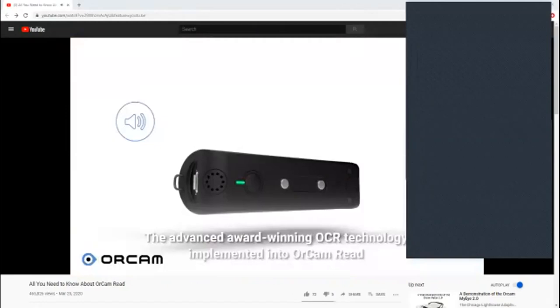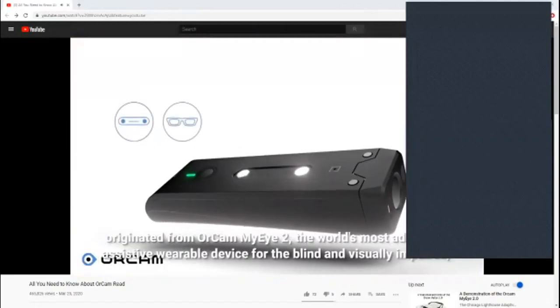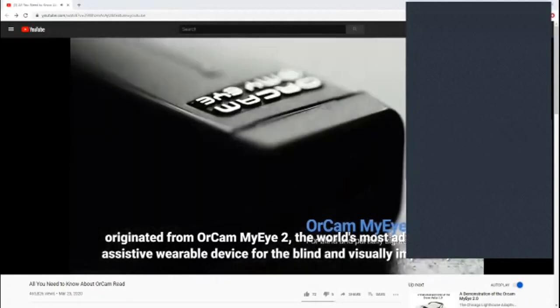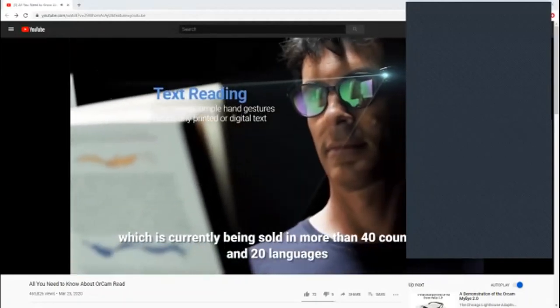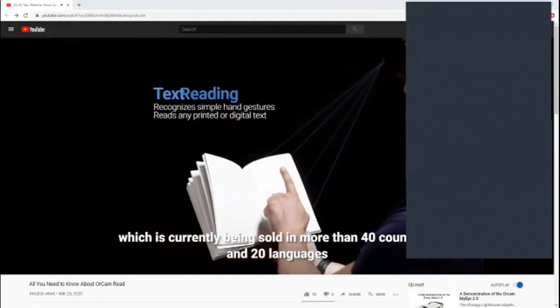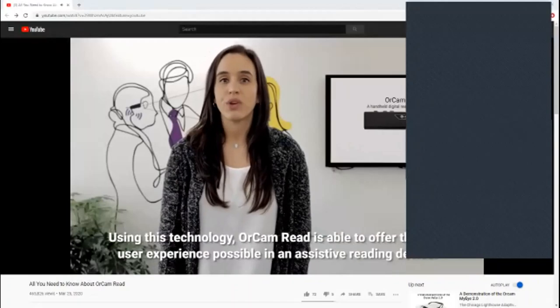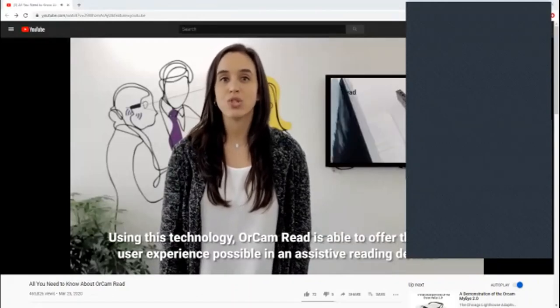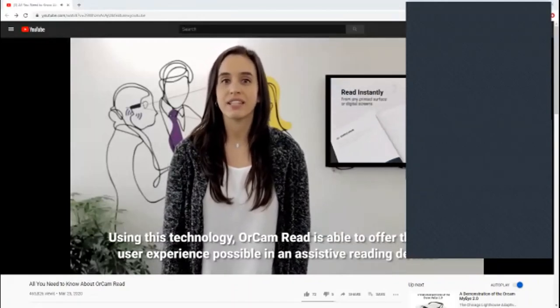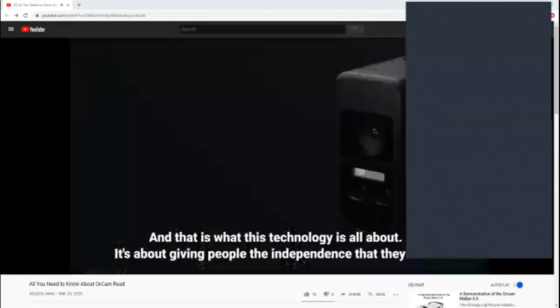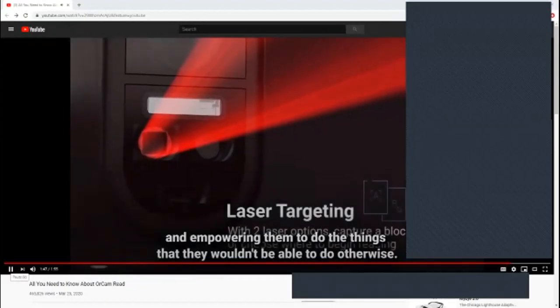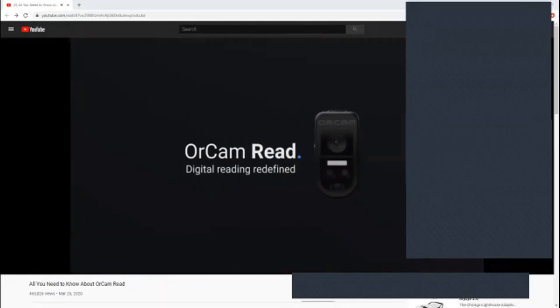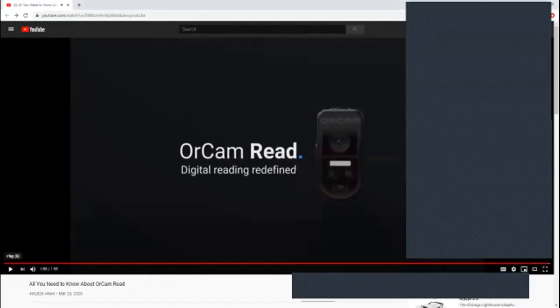You can connect to Bluetooth or wired headphones for private listening, leaving you free to multitask. The advanced, award-winning OCR technology implemented into OrCam Read originated from OrCam MyEye2, the world's most advanced assistive wearable device for the blind and visually impaired, currently being sold in more than 40 countries and 20 languages. Using this technology, OrCam Read is able to offer the best user experience possible in an assistive reading device. It's about giving people the independence that they need and empowering them to do the things that they wouldn't be able to do otherwise.